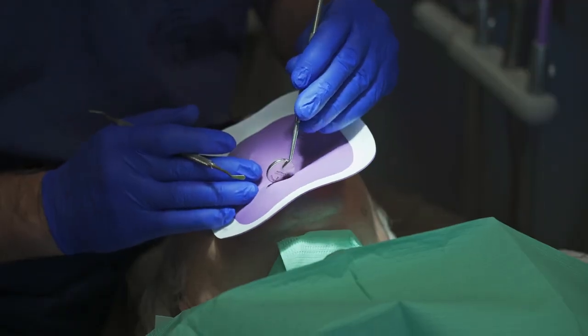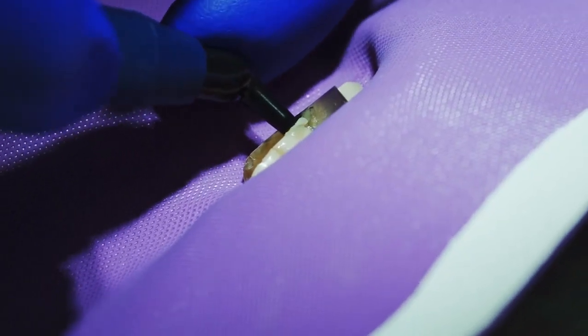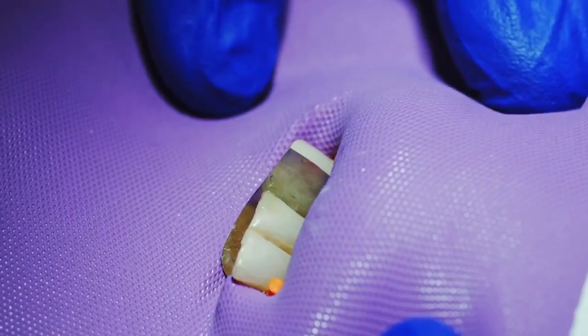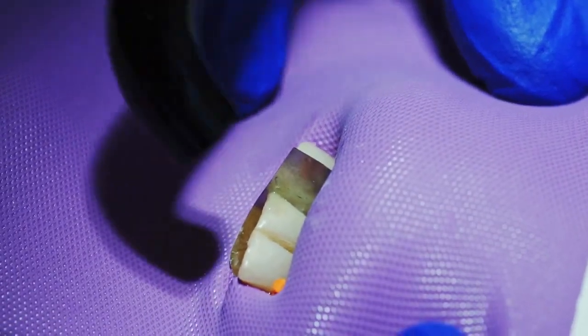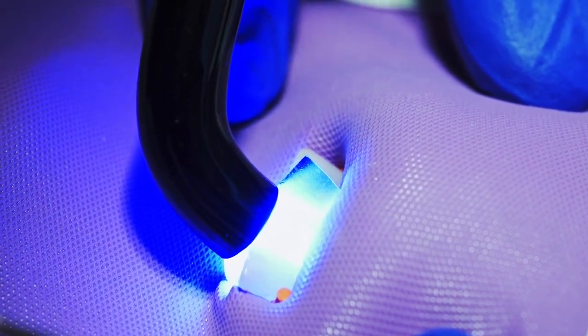With a big anterior repair, especially in the maxillary, it's amazing how bright the filling is with the glass inside of the tooth. Also, it's invisible.